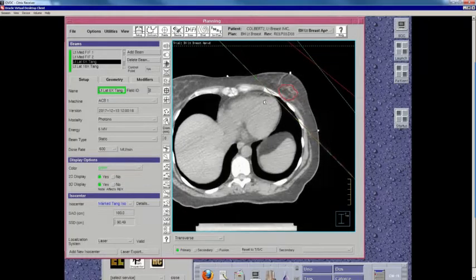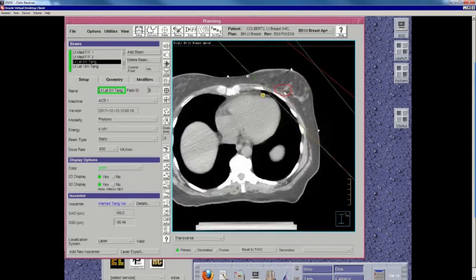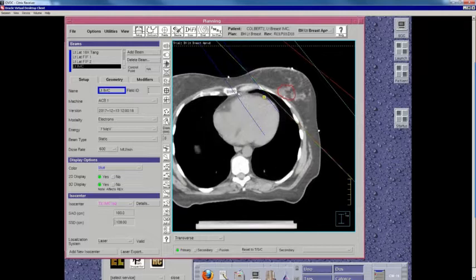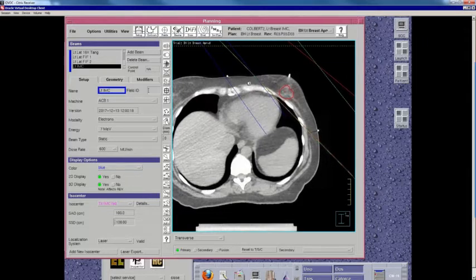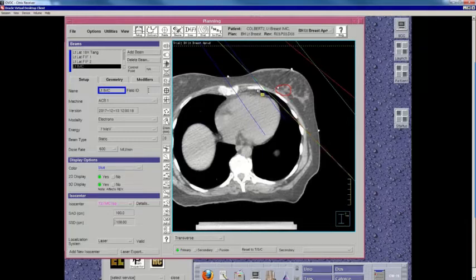Now this is a nice solution, but the downside is if we really believe that the whole breast is a meaningful target, we're actually not treating a lot of the breast tissue that's medial. And so what we can do to fix that problem is add a medial breast field, which in this case the dosimetrist called an IMC field, but it's not an IMC field, it's actually a medial breast field. This will then deliver dose with an electron field to the medial breast tissue. And if we're smart about the way we design this, we can get good whole breast dose coverage and minimize the dose to the LAD.